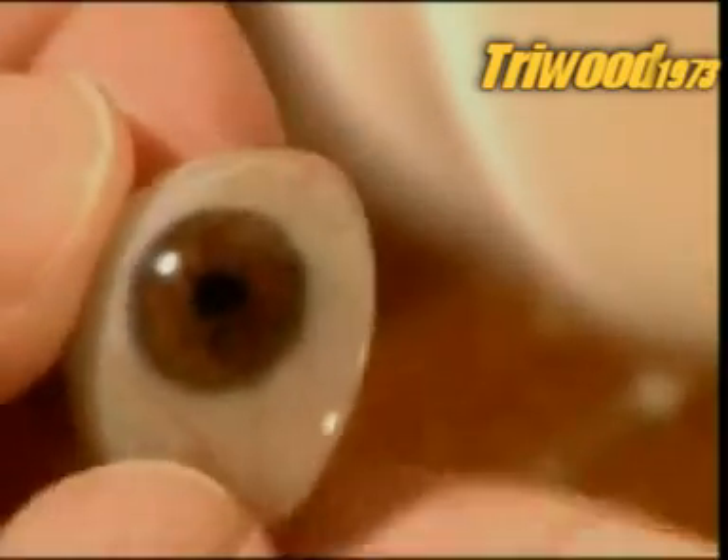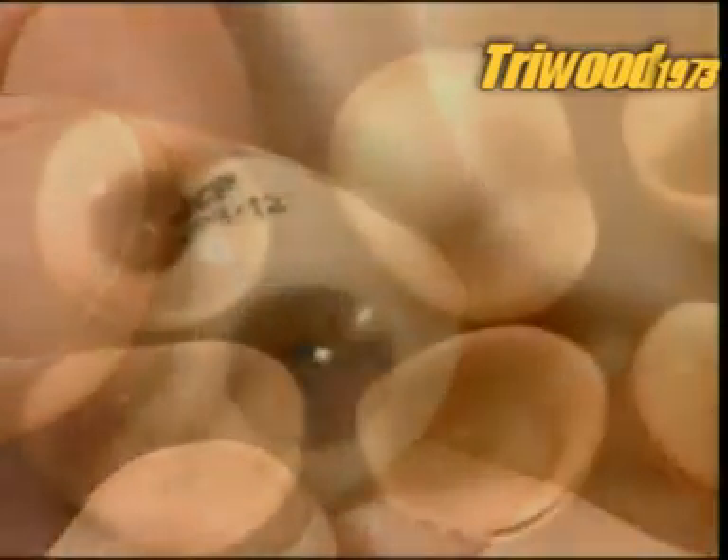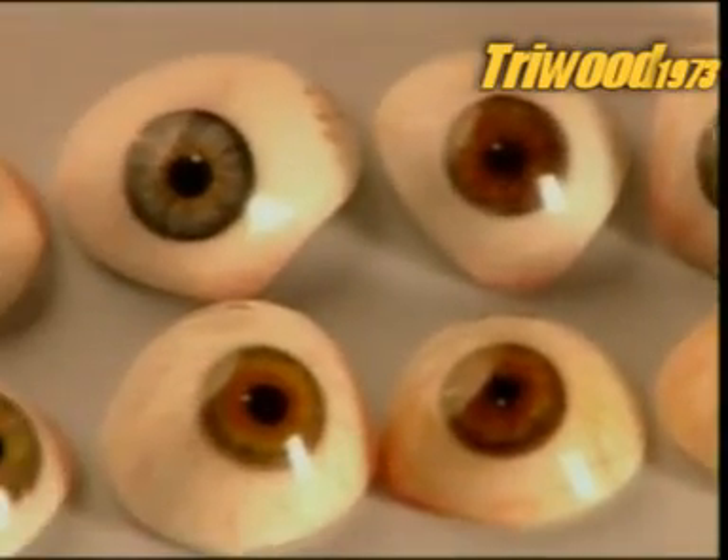Once satisfied the artificial eye is a perfect match, they seal the artwork with another acrylic coating. Once that cures, they polish the eye to a shine with a cotton wheel. The shapes and colours of artificial eyes are endless, because patients' eye sockets and irises greatly vary, as does the white of the eye.